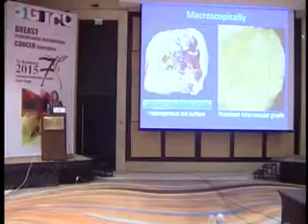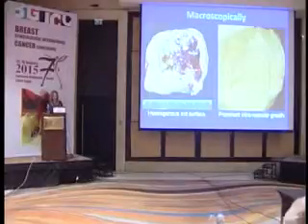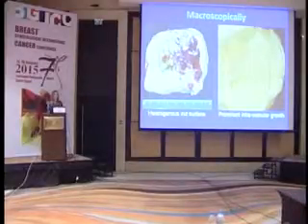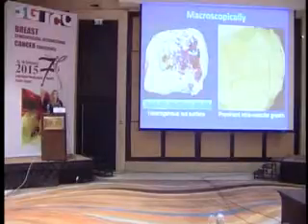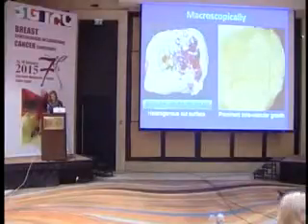This is my patient. This is after fixation. That was fresh. Okay, is it benign? Is it malignant? Raise your hand. Guys, you're tired and I'm tired. Stay with me, right?